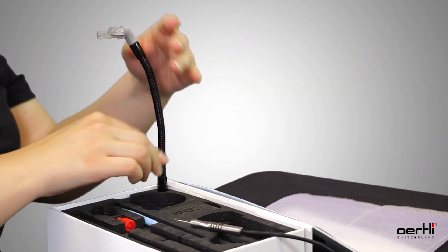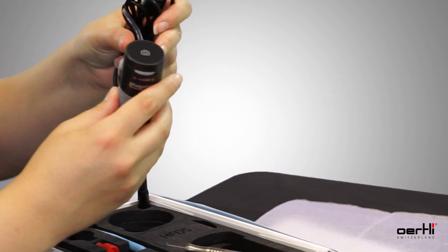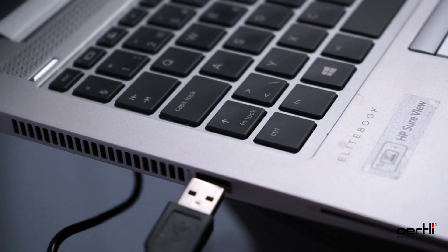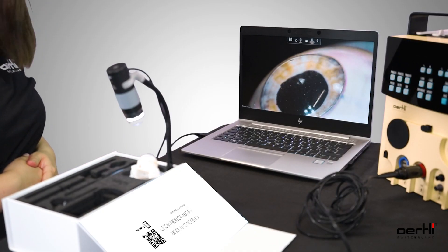Mount the USB camera with its holder and connect the camera via USB to your notebook. Open a camera-supporting program, for example Zoom.